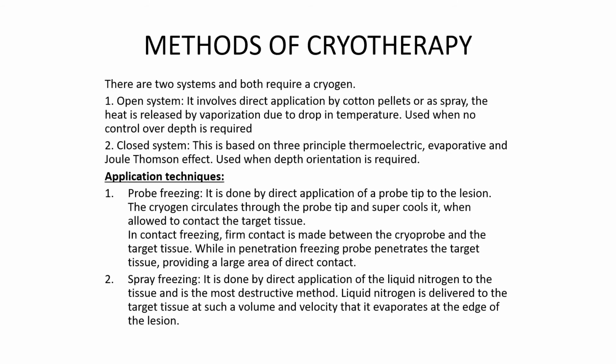عندنا اثنين probe freezing. It is done by direct application of probe tip to the lesion. The cryogen circulates through the probe tip and supercools it when allowed to contact the target tissue. بالcontact freezing, firm contact is made between the cryoprobe and the target tissue. بس بالpenetration freezing, probe penetrates the target tissue providing a large area of direct contact.